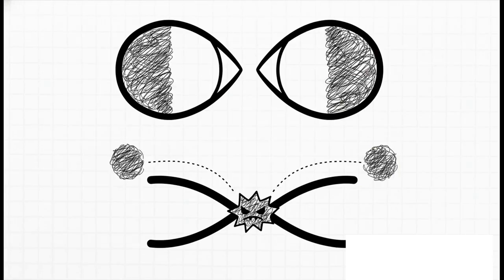And this right here is where the test becomes an unbelievably powerful neurological tool. Take a bitemporal hemianopia. That's the loss of the outer or temporal fields in both eyes. It basically creates a form of tunnel vision. This highly specific pattern points like an arrow to one single spot, the optic chiasm. That's the X-shaped junction where nerve fibers from each eye cross over. And you know what the most common cause for this exact pattern is? A pituitary tumor growing and pressing on that junction from below.